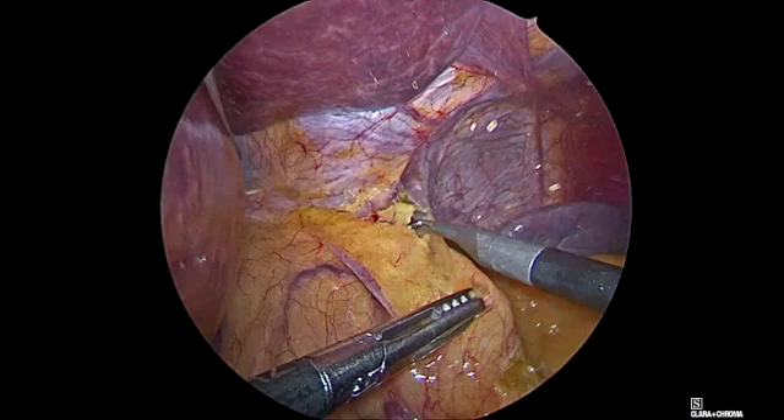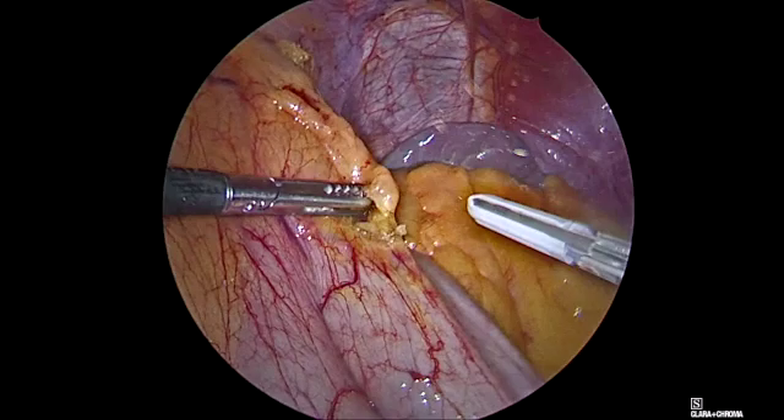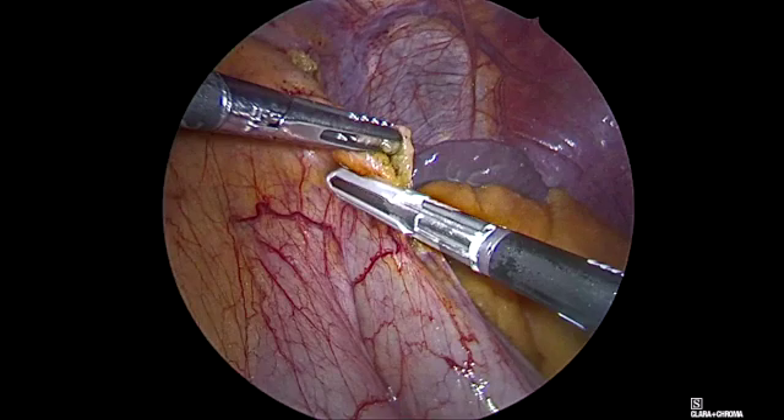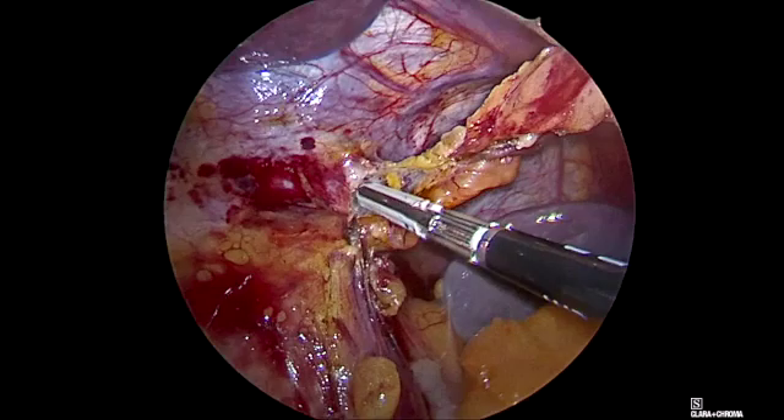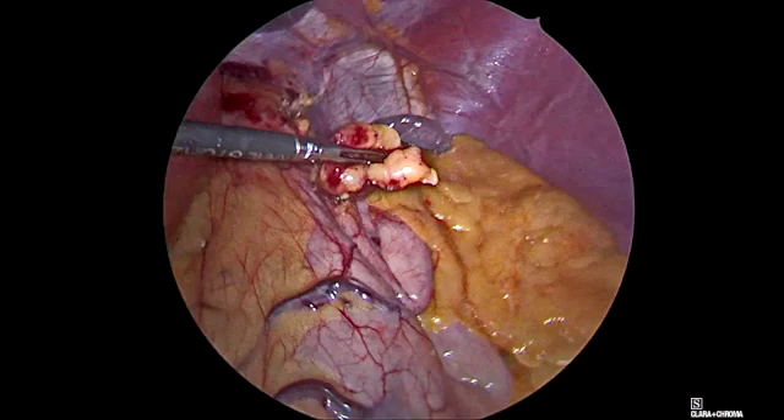We always start by removing the fat pads around the gastroesophageal transition because we want to see the gastroesophageal transition very clearly. These little specimens are always retrieved by the 12mm trocar.